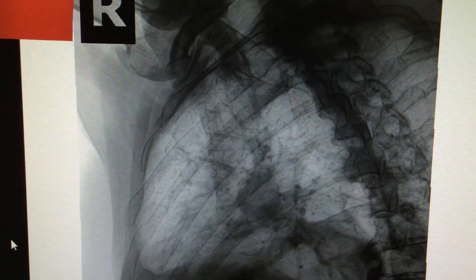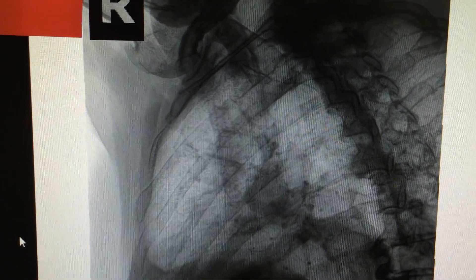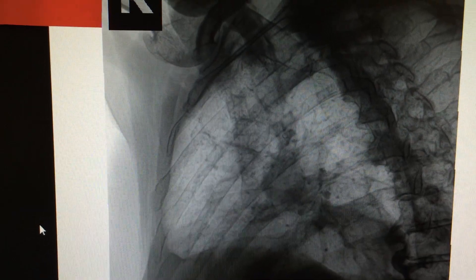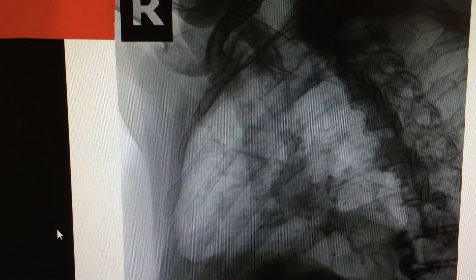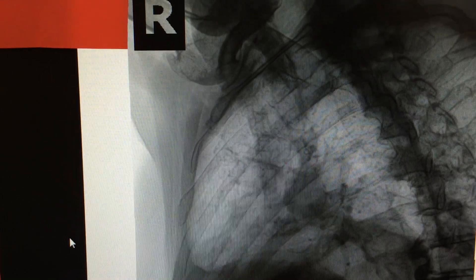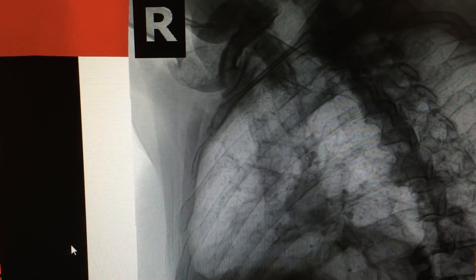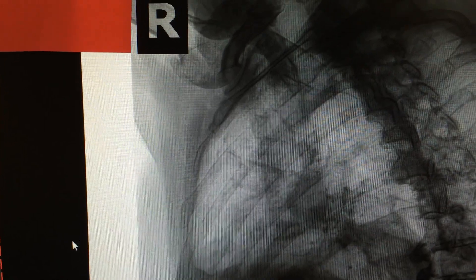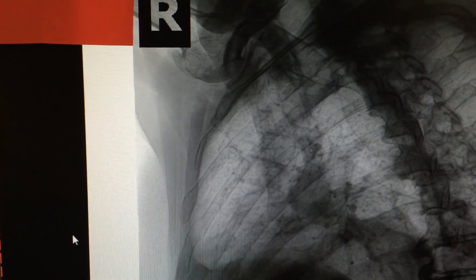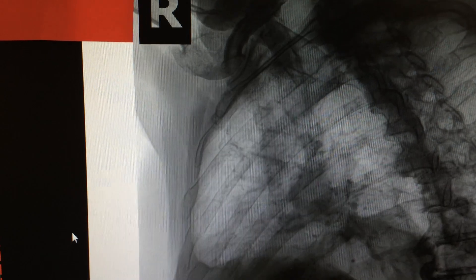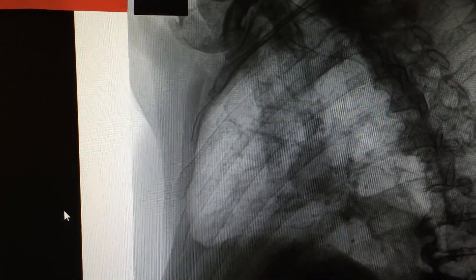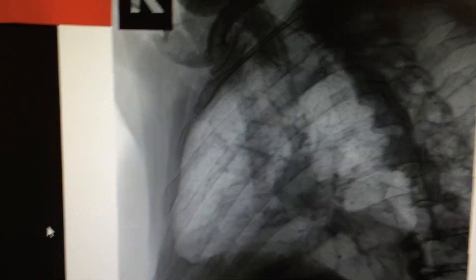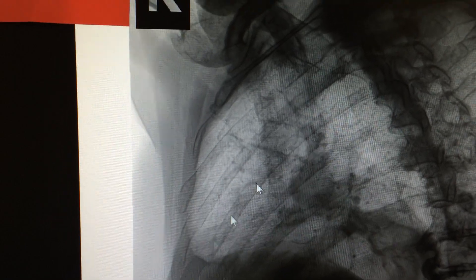Today I want to show you this rib fracture — displaced 6th and 7th rib fractures on this X-ray. I was seeing this patient not long ago. She was walking on ice, fell forward, and her elbow pushed into her ribs. This is the X-ray I took, and as you can see there is a very clear 6th and 7th displaced rib fracture.